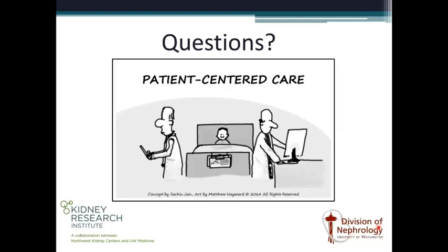Here at UW Medical Center, I don't work here, but I'm pretty sure it is offered as a standalone service through cardiology. I'm not sure how many monitors are available. But when you're putting in the order, you have to check off all the boxes that say this is a patient that doesn't have a diagnosis of hypertension, that has 3 blood pressures above goal in clinic and 2 at home that are below goal. And if you don't meet all those criteria, you're not supposed to order it because it's an unreimbursable service.